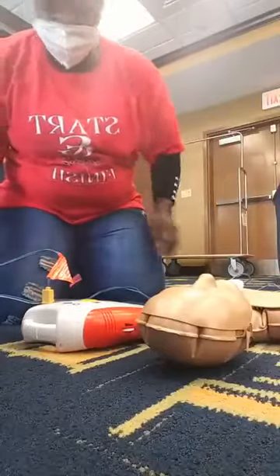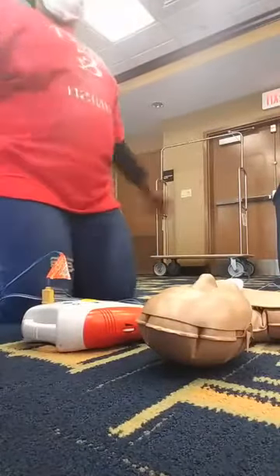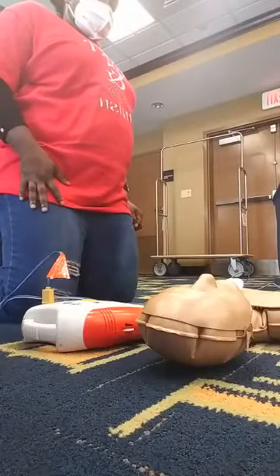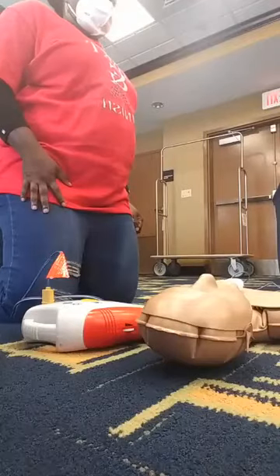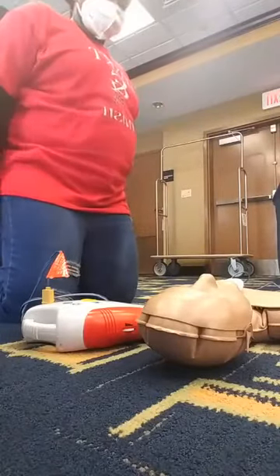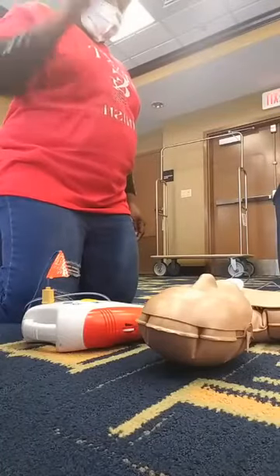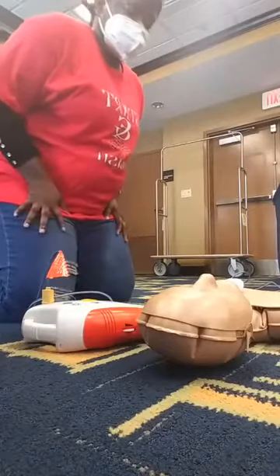Let me turn it on. Analyzing rhythm. Everyone stand clear. All clear. Shock advised. Charging. Everyone stand clear. All clear. Everyone stand clear. Push the shock button. Deliver the shock. Begin 5 cycles of CPR.